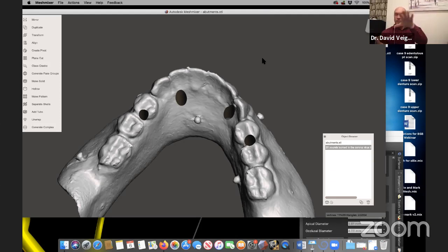I've got a new soft tissue, which I've taken with a reline of light body silicone. I have an occlusal registration. I take all of that downstairs, I pour models, my master model, and I articulate that. I also take DSD photos of the patient with that prosthesis in place. So now I can relay all that information to the lab.